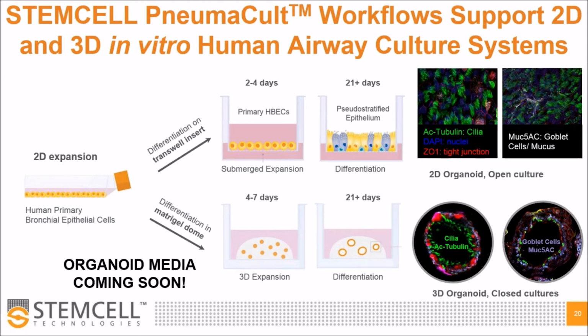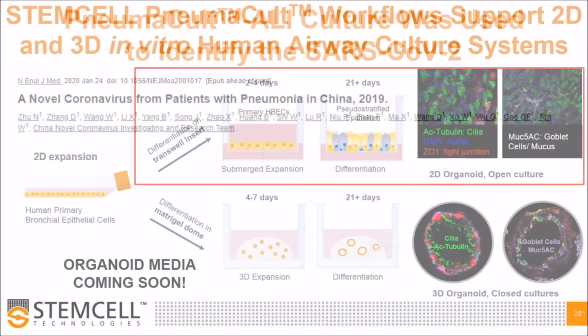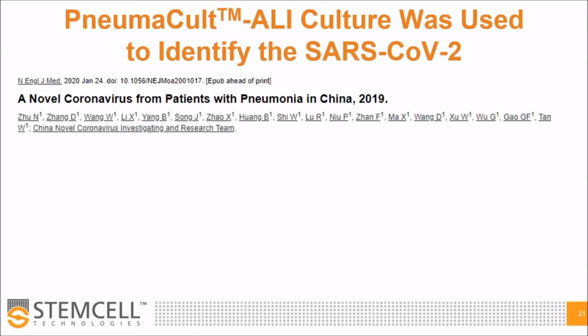As I mentioned in the first part of this presentation, air-liquid interface systems are the gold standard for studying respiratory viruses. Knowing this, scientists working at the CDC in China decided to use this culture system to identify what was causing this terrible bilateral pneumonia that was leading to the death of so many people. The severity of the situation pushed these scientists to use a robust system from which they could obtain results as quickly as possible.